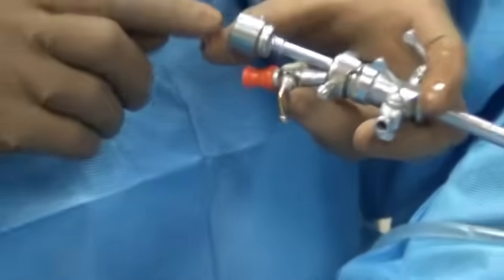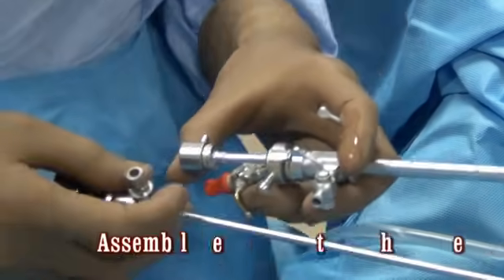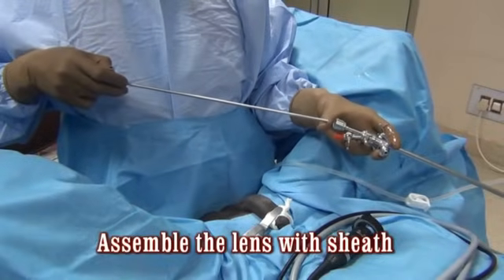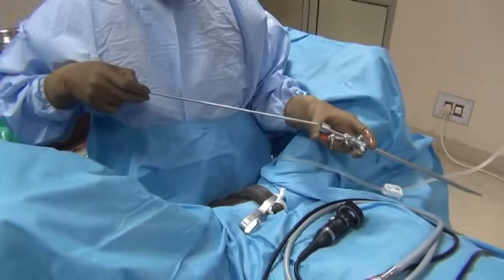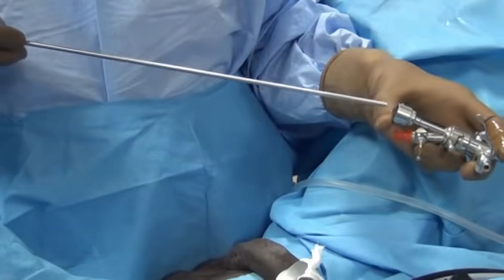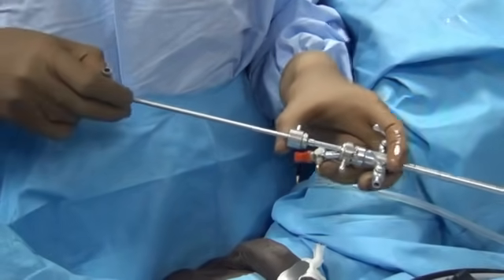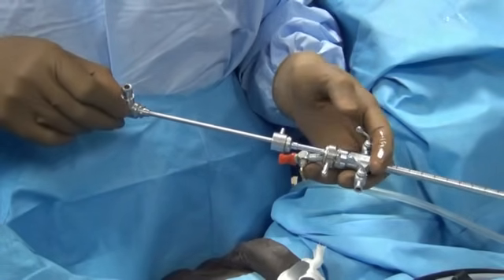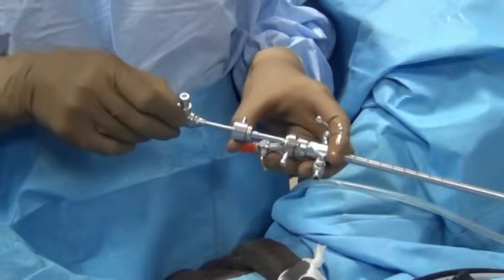Next, put the lens into the sheath. This is the 30 degree lens. When introducing the lens, keep your thumb here and let the tip of the lens rest on the thumb. If you just push it in without the thumb, you will wobble and hit the tip of the lens against the back of the bridge, traumatizing your lens. With your thumb in place, rest the lens on it and gently advance the scope into the bridge. Sometimes, due to excessive use, there is some banding and you may encounter resistance — so be careful. If there is resistance, don't push; it will gently advance on its own.